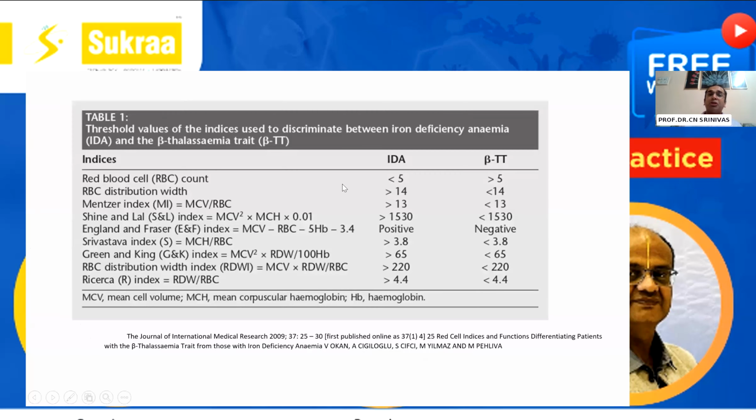So what are the threshold values of these indices in differentiating iron deficiency anemia from beta thalassemia trait? So these are the indices. I will not again read them, but very common. I think most of us, which we were advised to follow as PGs, was look at the RBC count. If it's more than 5 million, you do advise for a Hb electrophoresis, HPLC, to rule out a thalassemia trait. That I think should go hand in hand. Whenever RBC counts are high, see in the microscope, look for the microcytosis.